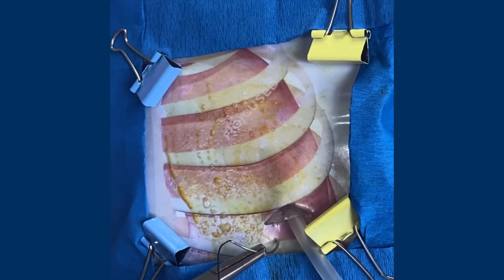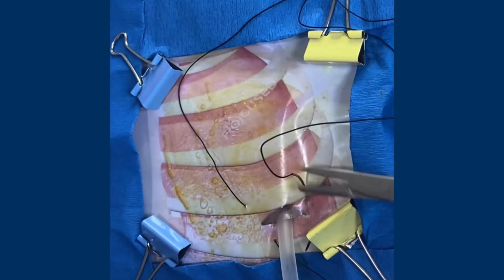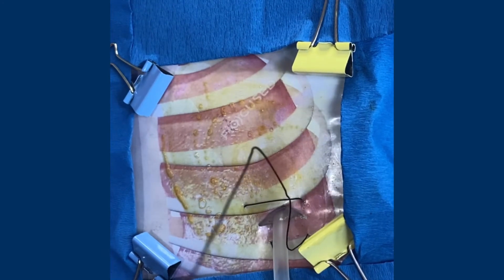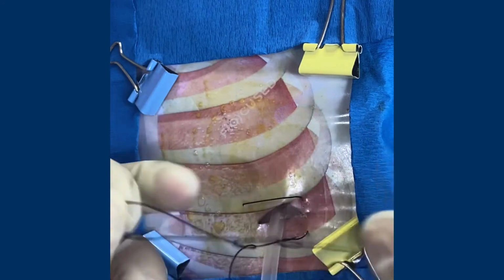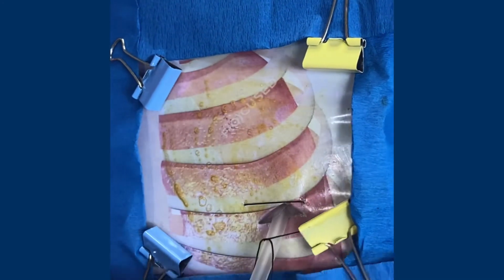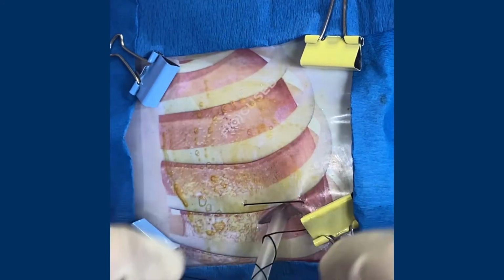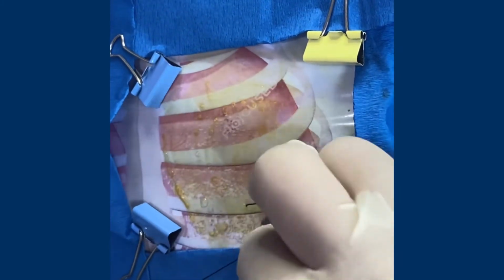Suture the chest tube to the skin with a silk O by placing a horizontal mattress. Cut the needle and throw it in the sharps to avoid puncture wounds. Tie the suture in place. Wrap the remaining sutures around the chest tube to secure it. Make at least 4 loops to secure it in place. Push the suture down and secure with a knot.